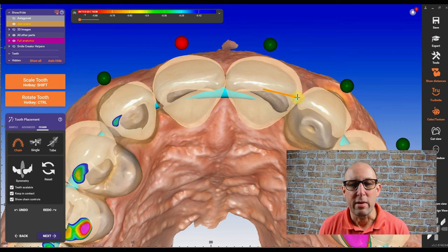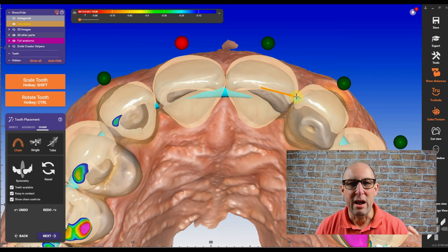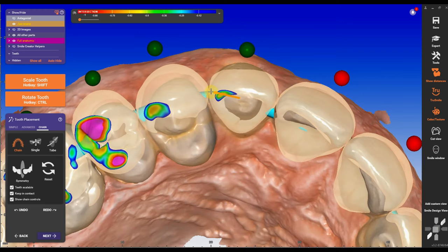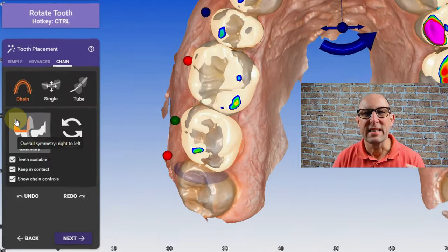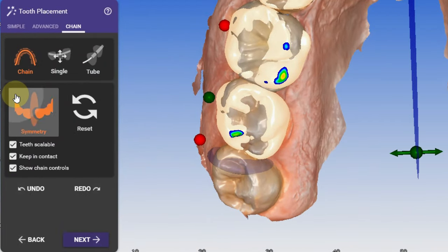I can lock areas, I can free areas, I can move sections. My case is really special because you can see I don't have any laterals.